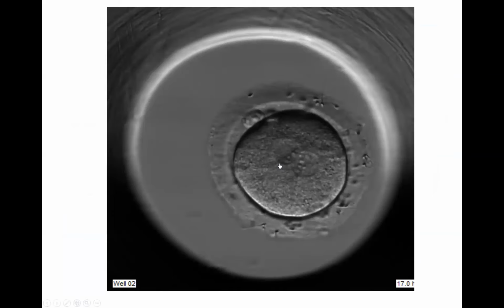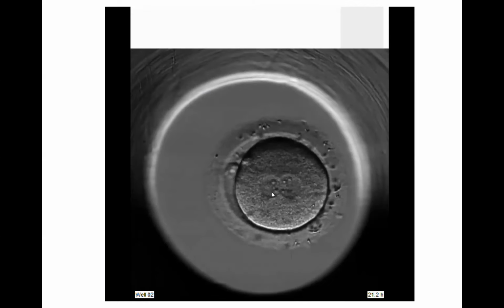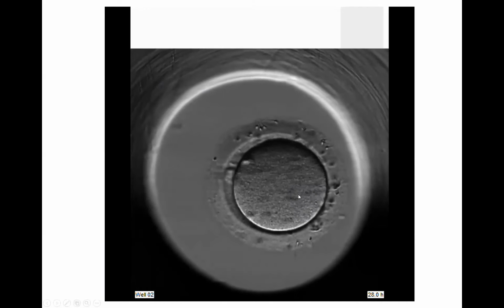So I showed you that diagram of the uterus and all the embryo development. Now I'm going to show you a time-lapse video of an embryo actually developing. You can see here, these are in culture, and it has 2 pronuclei. You can see them right here, and they're coming together, right? Because eventually the male and female DNA come together, as you just saw. I'm going to stop it. They just came together and underwent syngamy. As soon as they undergo syngamy, it's now a 1-cell embryo, and it has the DNA that it's going to have when it's a fully formed person, if it continues to develop.